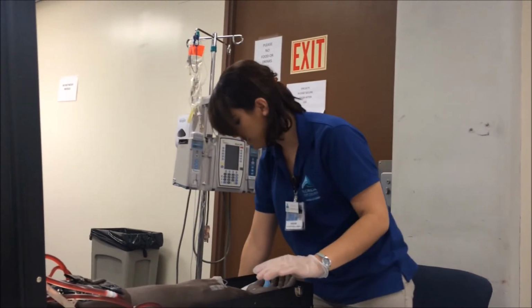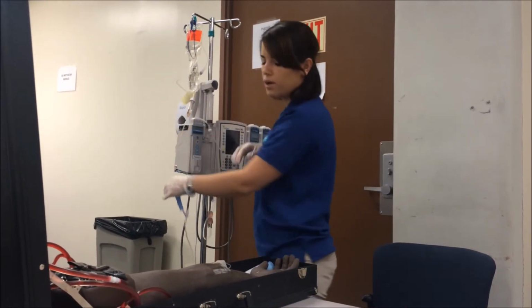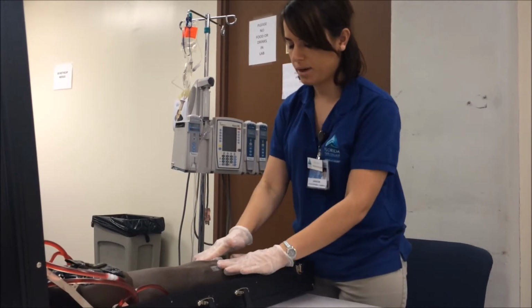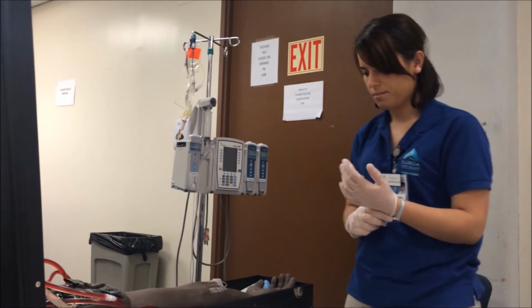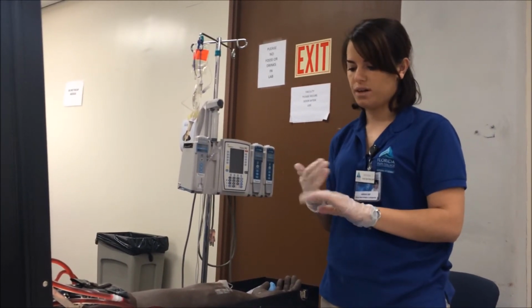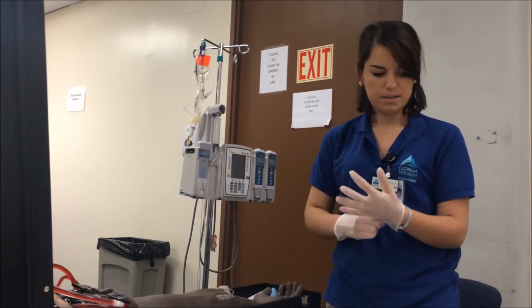Okay, so I will once again go ahead and look at my patient's site to see if my patient had any adverse reactions to the drug. Okay, and my patient, there are no adverse reactions to it. He's doing good. And I will also make sure to look for any infiltration, phlebitis, or redness or swelling, and there's none present.